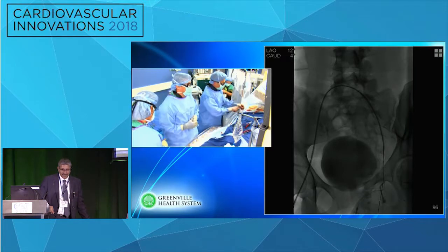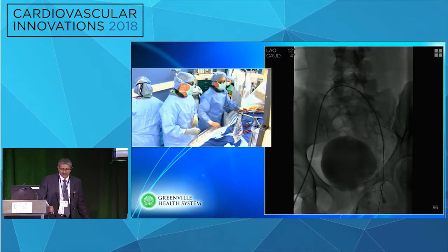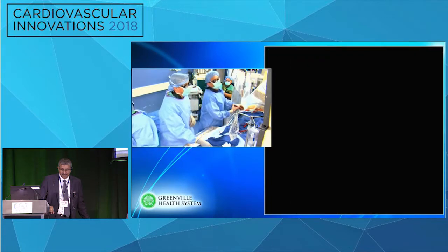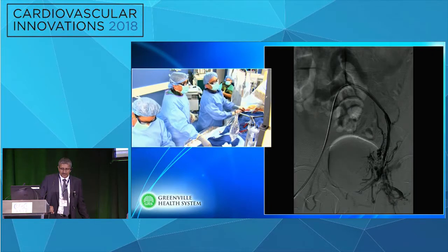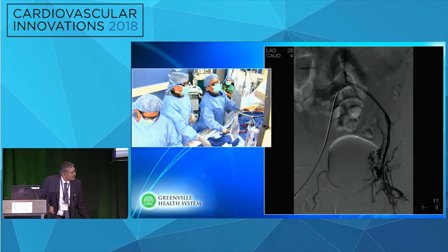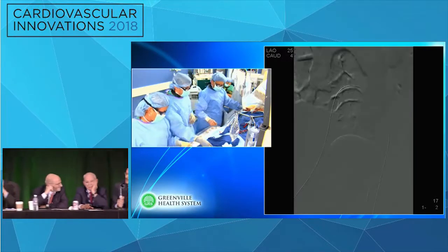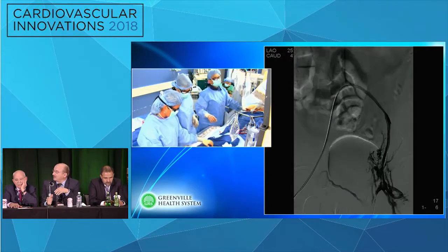I agree with those comments. Those make a lot of sense. Sorry, back to the sizing of the vein. You can never size a chronically inflamed vein. You don't know what the size was originally. Whatever you size is not known. So you go with the size of the other vein, almost, and go with that if you want.